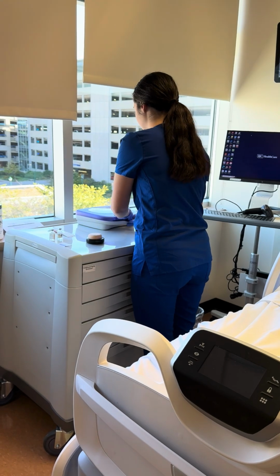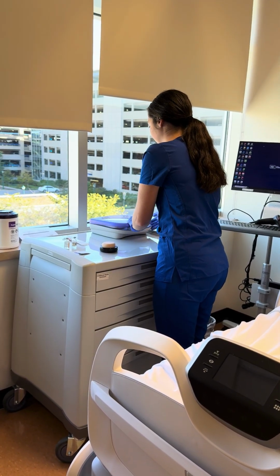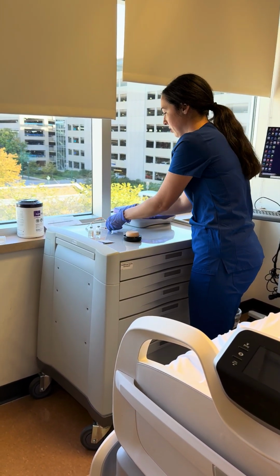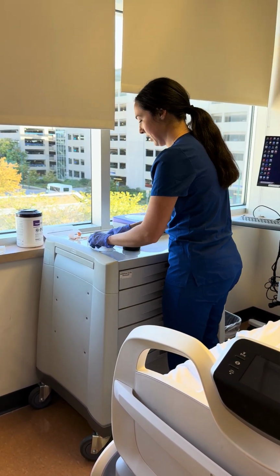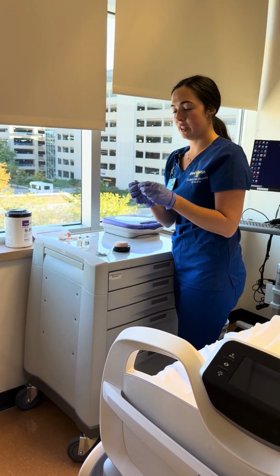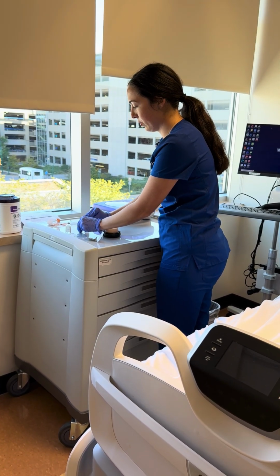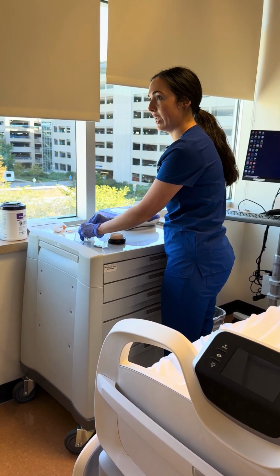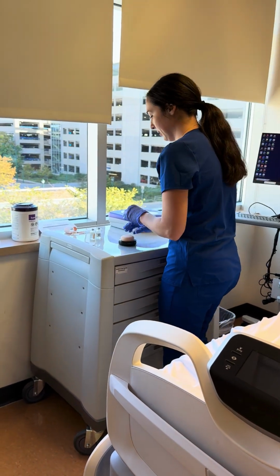So I'm going to go ahead and open this up here. I'm going to take another alcohol wipe. Okay, I'm going to open up my sterile needle here, my insulin needle. And I'm going to take an alcohol pad. I'm going to scrub the hub of each of these for 30 seconds just because it is communal. So 28, 29, 30. The second one, 28, 29, 30. Okay, so now that is that. I'm going to place that off to the side.